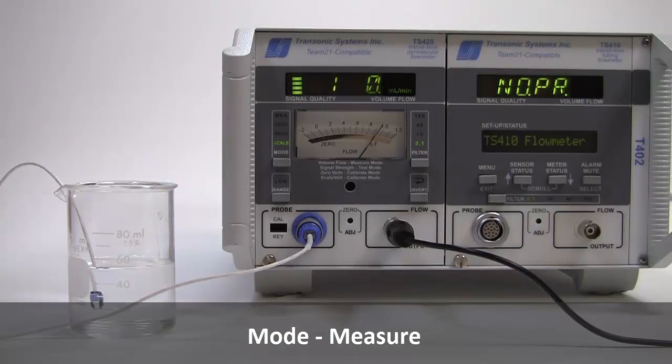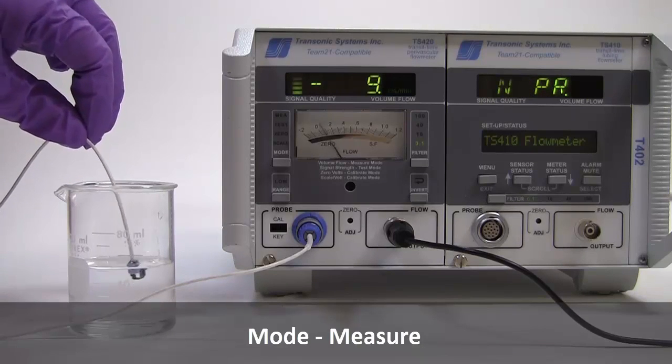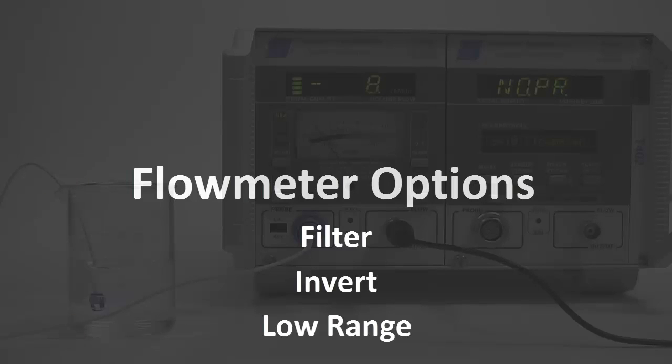Back in measure mode, the digital display will present the average volume flow in milliliters per minute. The analog meter will register flow proportional to the flow probe scale, and the signal quality indicator will again be illuminated to monitor acoustic coupling. There are a few more options available to us on the flow meter: filter, invert flow, and low range.